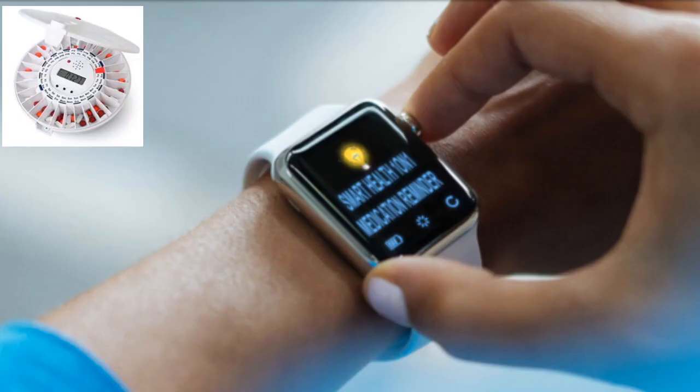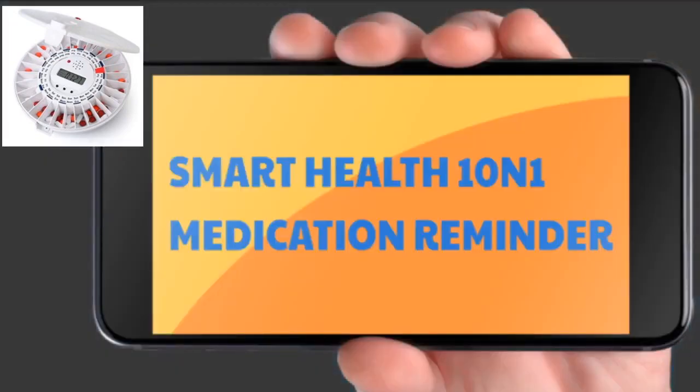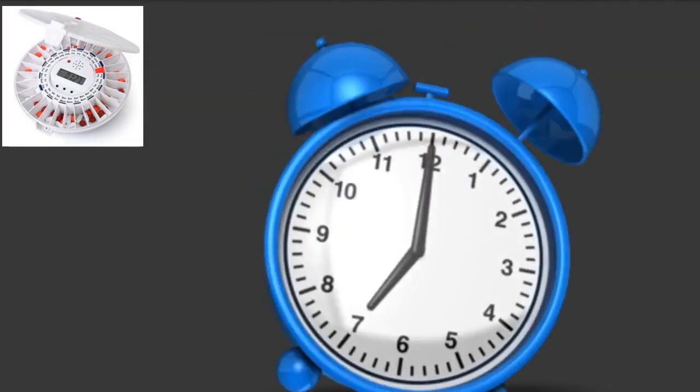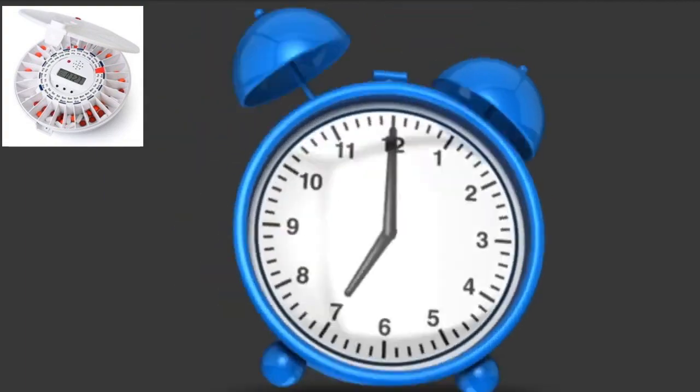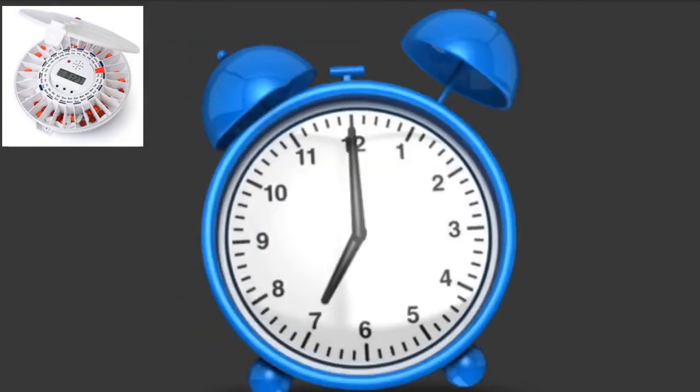If this product is in use, then there are many other options available. The dispenser will know if and when the medication was taken and if it wasn't. In some areas, the pharmacy will mail a pre-filled tray to the user's home and all that is needed is to set the tray into the dispenser. The dispenser will do the rest.